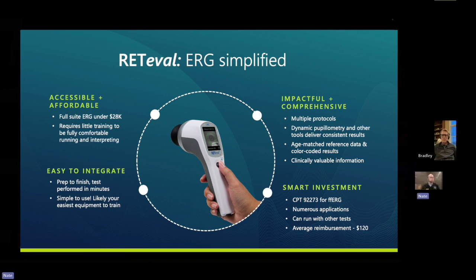Dr. Grant, I have been so amazed that when you bring this to the patient and you tell them that, they're just like, wow, this doctor knows what they're doing and they are going to really care for me. Have you had a similar experience? Yeah, I couldn't agree with that more. And I set it up the same way in terms of using the EKG reference, because everybody knows that term. But I make sure to say that we're measuring the speed and the strength of the retinal response to light. I think they can identify with those terms, and then even go a step further and say, if there's a problem, a lot of times we're going to see that signal weaken or slow down. And the way the displays, which we'll get into in a minute, are laid out, I think it's really easy to touch on those two terms, which they understand, speed and strength.